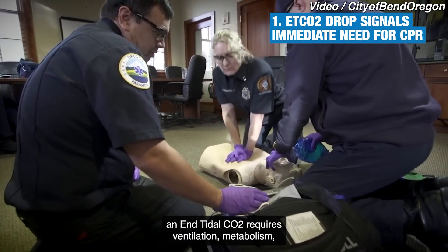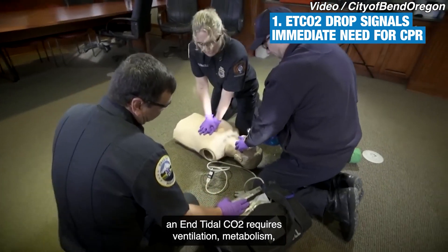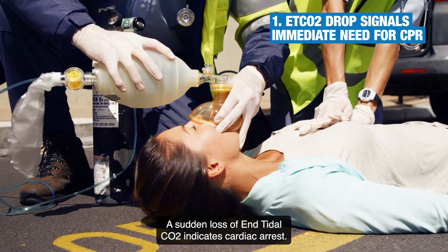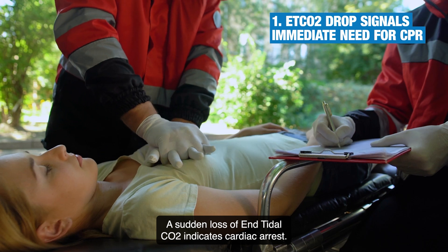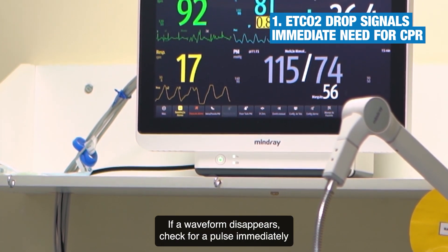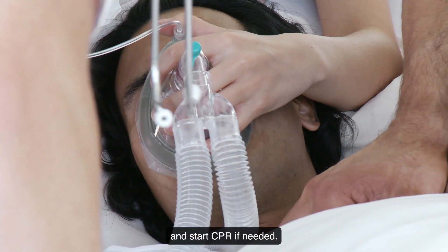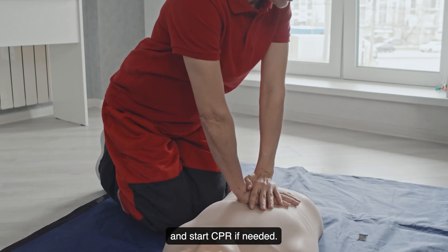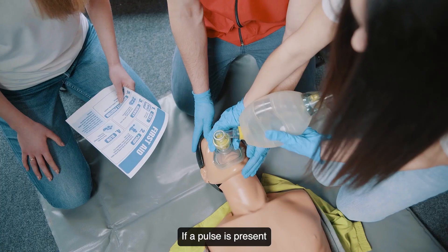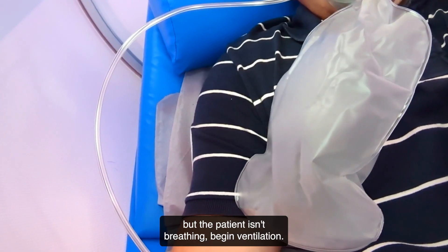End-tidal CO2 requires ventilation, metabolism, and circulation. A sudden loss of end-tidal CO2 indicates cardiac arrest. If a waveform disappears, check for a pulse immediately and start CPR if needed. If a pulse is present but the patient isn't breathing, begin ventilation.